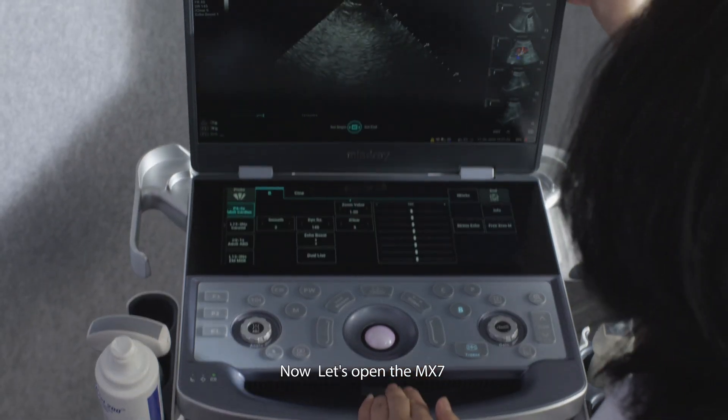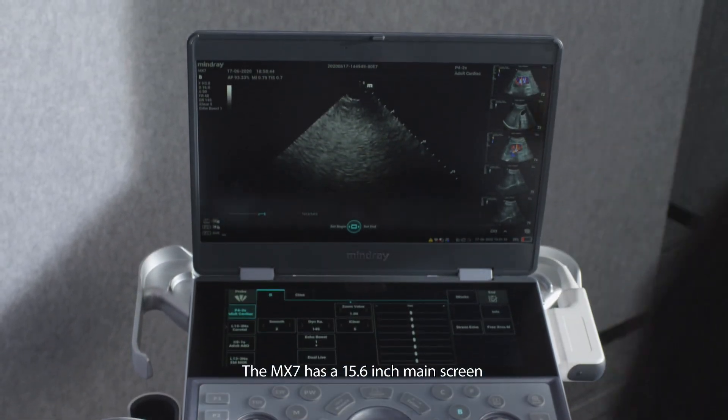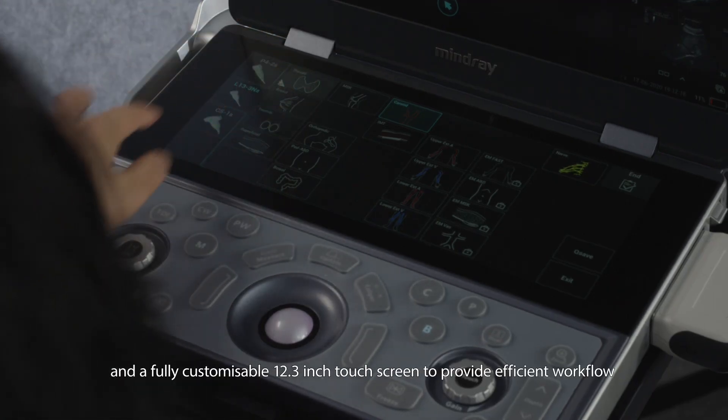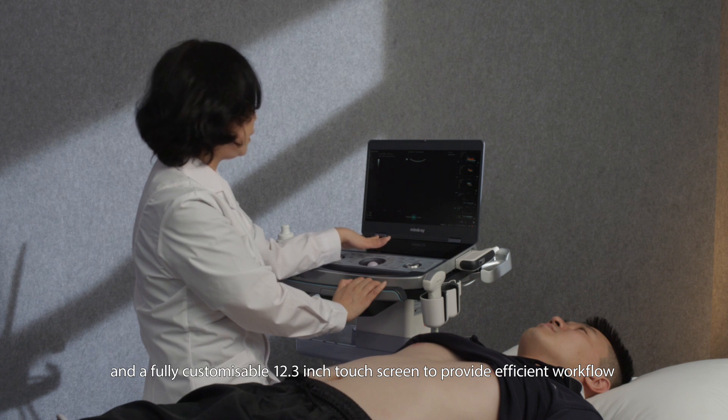Let's open the MX-7. The MX-7 has a 15.6 inch main screen and a fully customisable 12.3 inch touchscreen to provide efficient workflow.